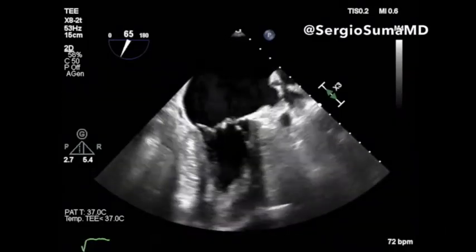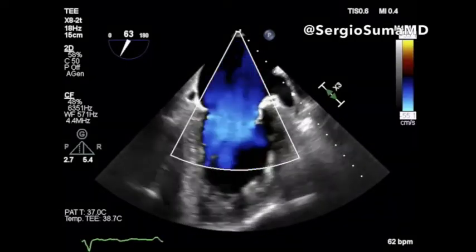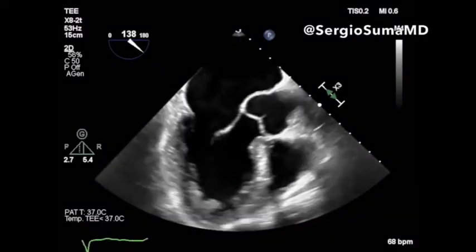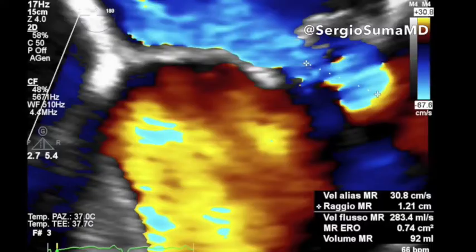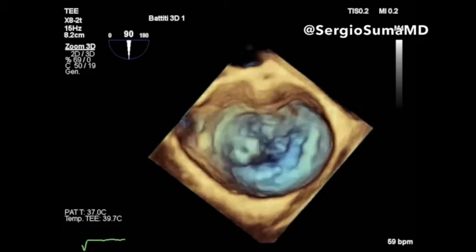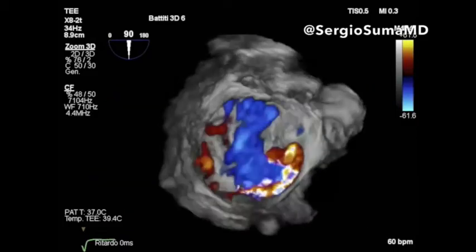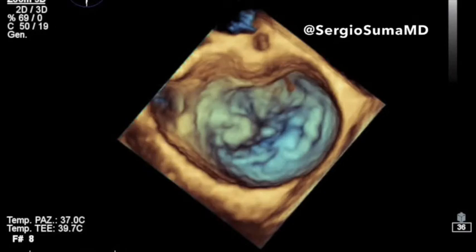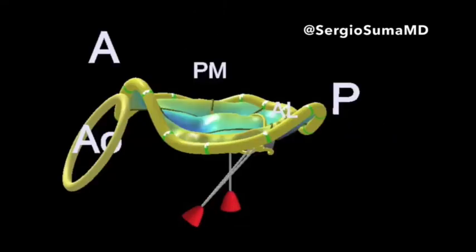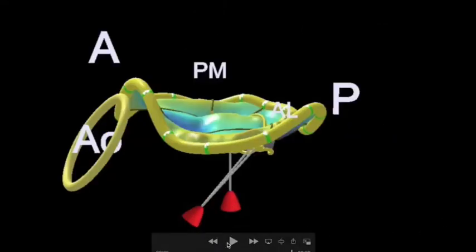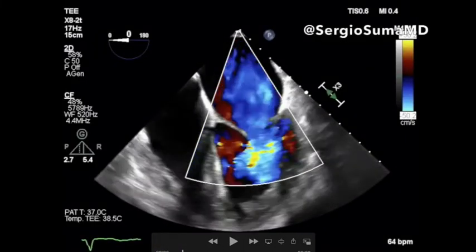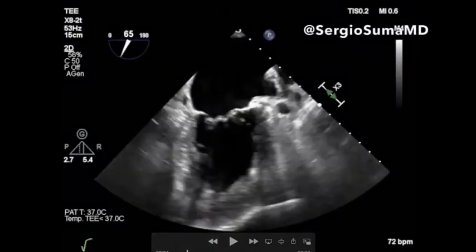This is another case of severe mitral regurgitation due to prolapse of the valve, with a severe eccentric posteriorly directed jet. The prolapsing area is the commissural part of the valve in the lateral part of the valve. As we look at the case, we can see that the jet is very eccentric, almost horizontal.